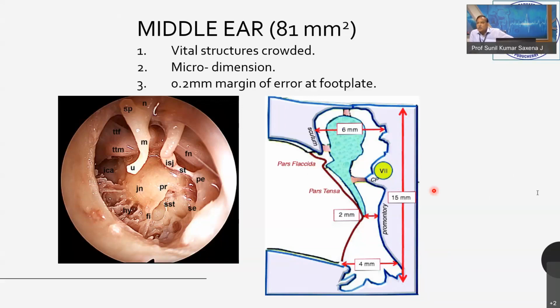You can use gel foam. I'm not saying not to use it. We are not used to that gel foam. We were using gel foam in the beginning. What happened? Gel foam got stuck to the flap, leading to fungal infection. After that, we have stopped using the gel foam. But yes, you can use the gel foam.